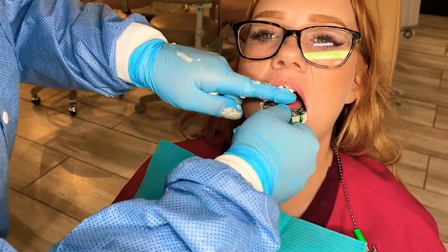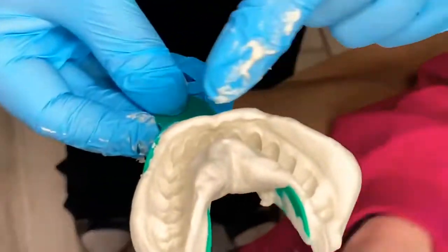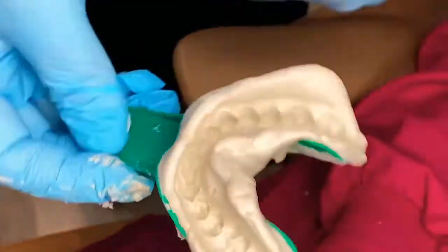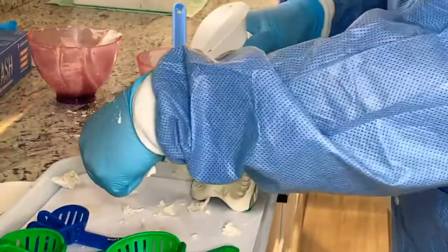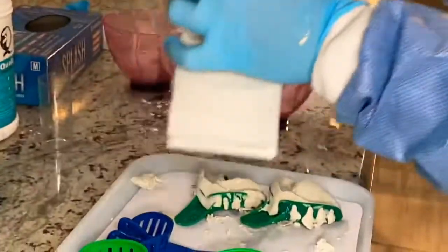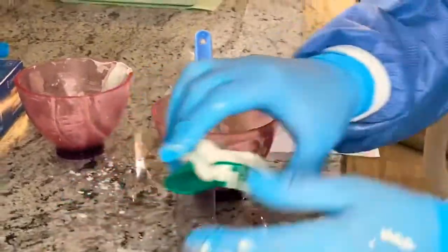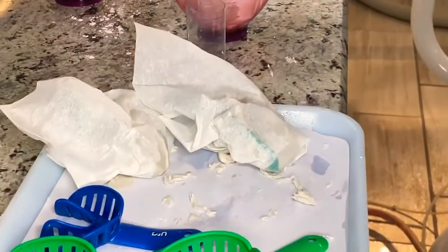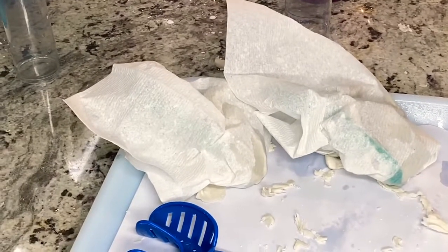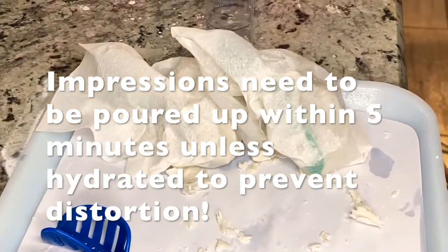Once you can't push your fingernail into it, I'm going to put my finger here and gently rock it out. Again, we have all of the lip roll, the rim everywhere, and the tongue impression — we have a great impression. I'm going to spray them with cavicide and wrap them in a towel. The cavicide will help eliminate any bacteria and pathogens on them. The paper towel is usually a wet paper towel to keep the impressions from shrinking, but we're going to go directly pour them up now so we don't have to worry about them distorting.